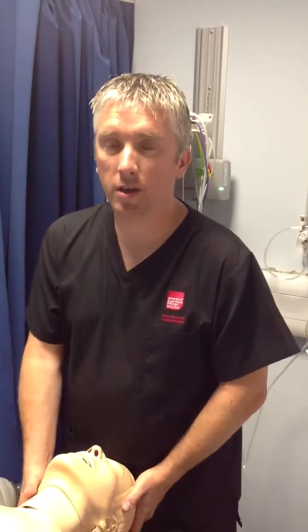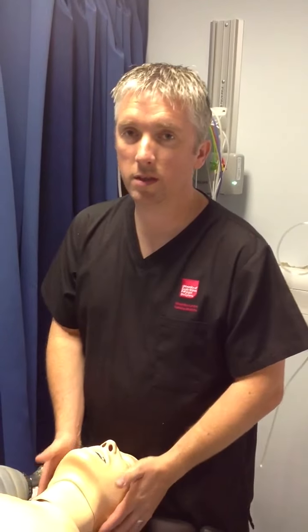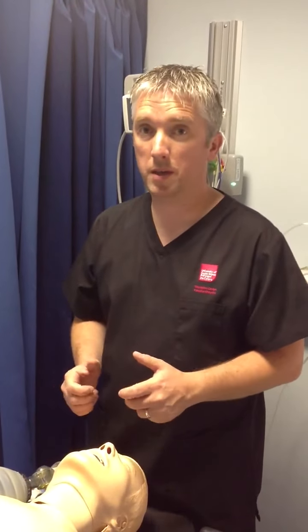My name is Andy Parry, I'm a senior lecturer in critical care at the University of South Wales. I'm going to show you correct bag mask technique.